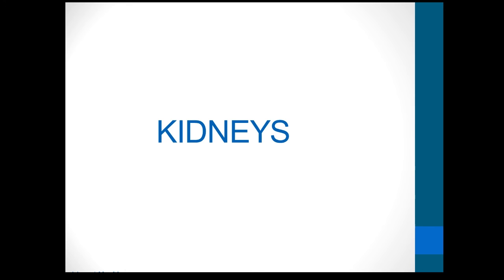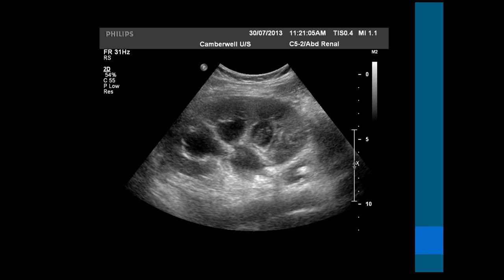In an endometriosis assessment, it's probably also important to look at the kidneys, because endometriosis can grow on the ureter in the pelvis and therefore obstruct the ureter, and it can cause silent hydronephrosis. So looking at the kidneys is probably a good idea, because it may not cause a lot of pain, but it can cause quite a bit of destruction to the kidney. And the ureters can sometimes be seen.